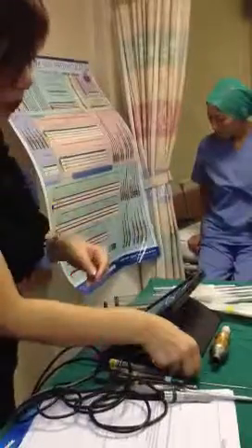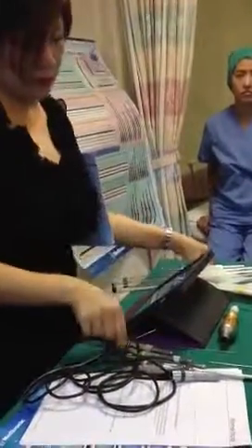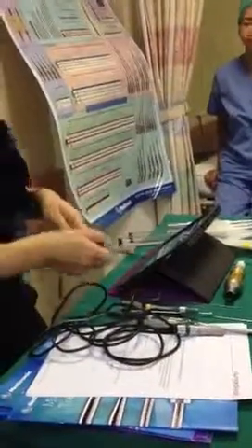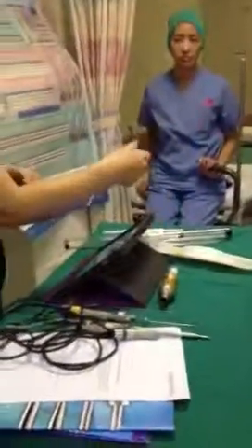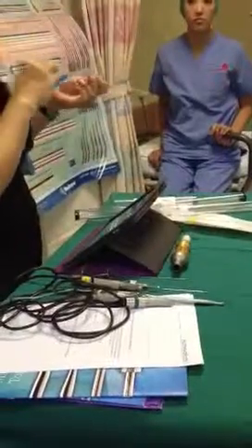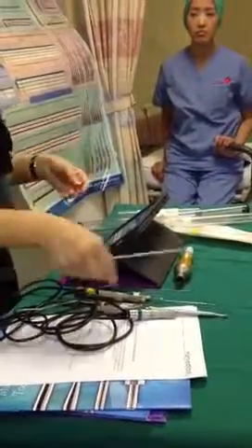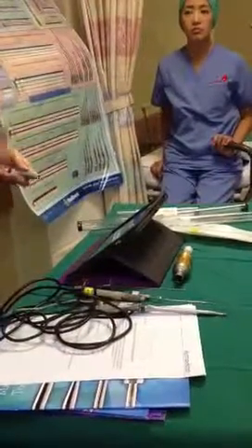Always remember, when you clean, brush through in one direction. Okay? So far, any problems? On the other hand, because this brush is metal, I'm going to give you the brush and put it in the sterile set. So the circulating and scrub nurses can clean it a bit intra-op.